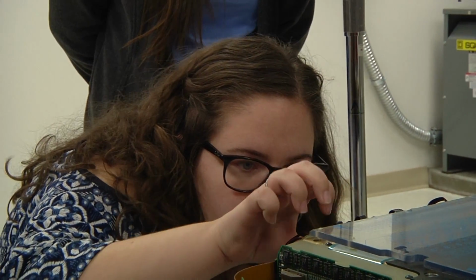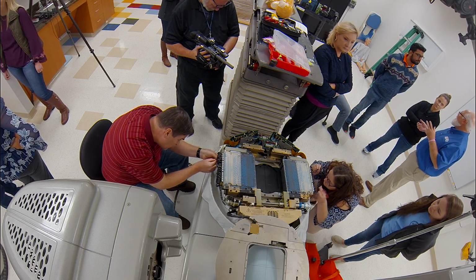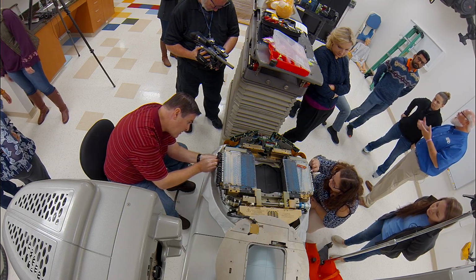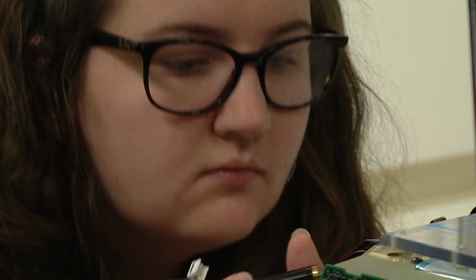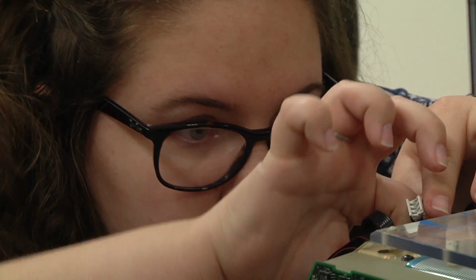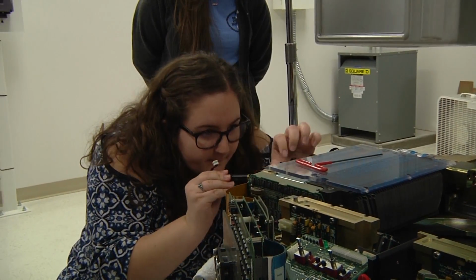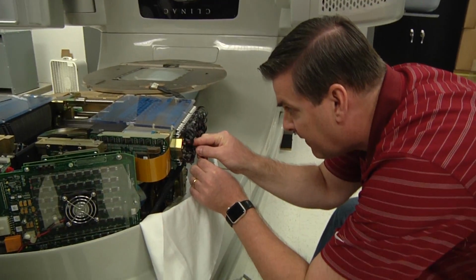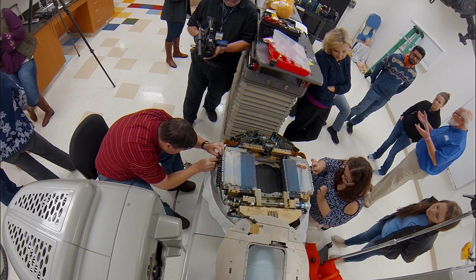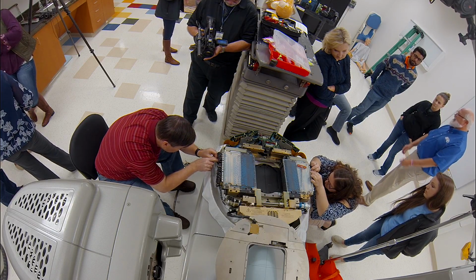That's actually a good question, because you'll hear this scenario quite a bit. There's a lot of screws in there, and all of a sudden one will come loose, and your patient will say, "Something's rattling in there." Some of the hardware just comes loose by itself. Or I mentioned these tie wraps, they get brittle, they'll break off, and the head of the tie wrap, the thick part, makes a lot of noise because it bounces around in that fiberglass. It's kind of disturbing for the patients to hear that rattling sound. But eventually, where that always ends up is in the high voltage, and it shorts something to ground.